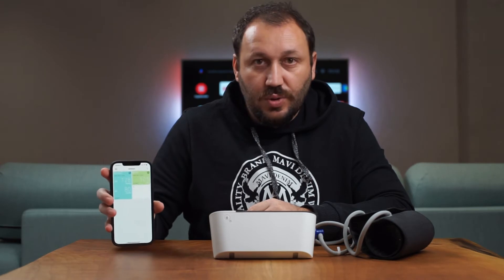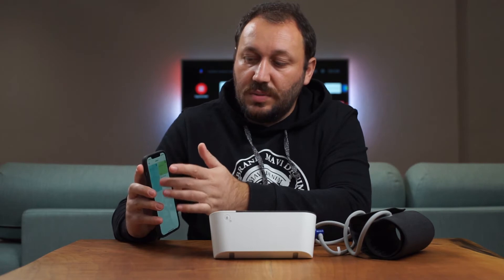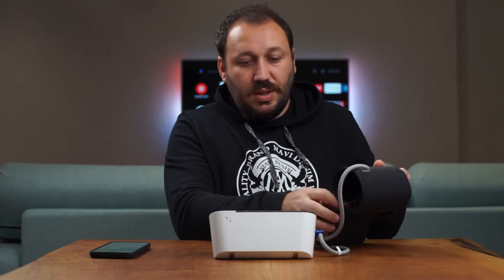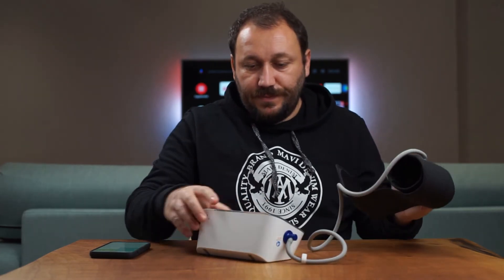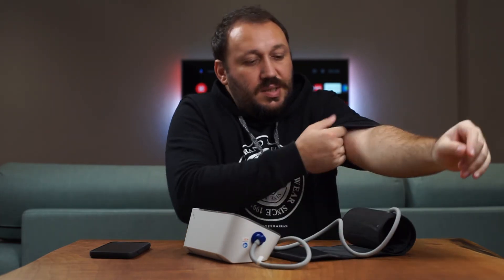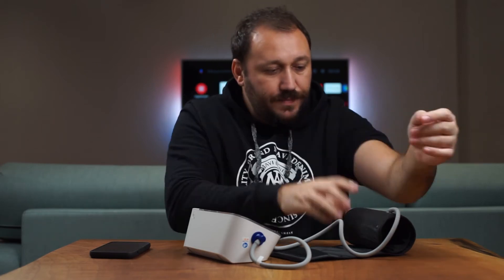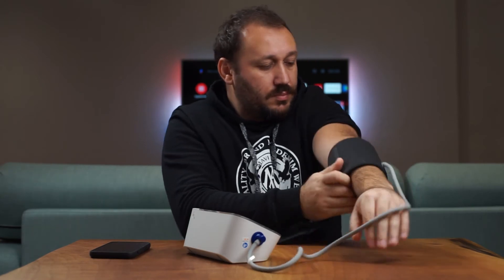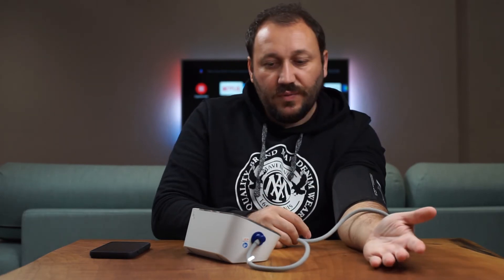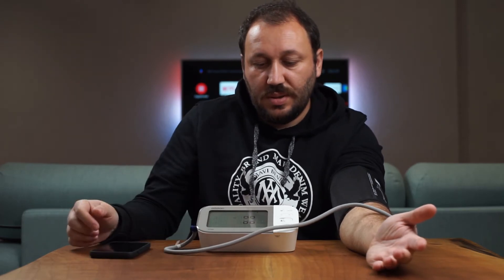The app shows your heart rate and blood pressure and monitors every time you measure. I'm going to do a quick demo — it's already synced. This is the upper arm monitor; you place your upper arm in it and you need to be relaxed. I'll just press the start button now.